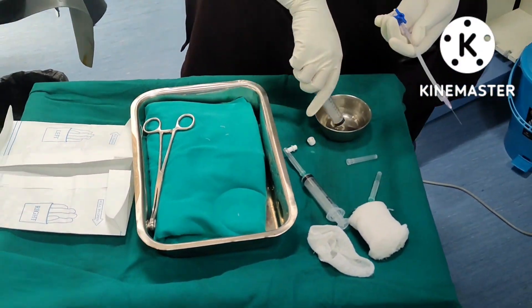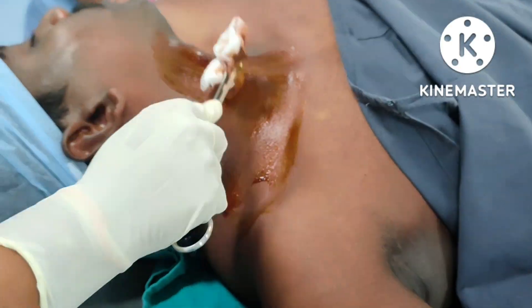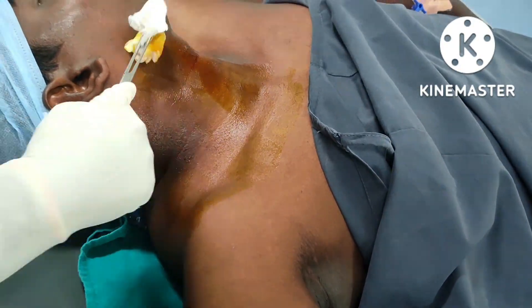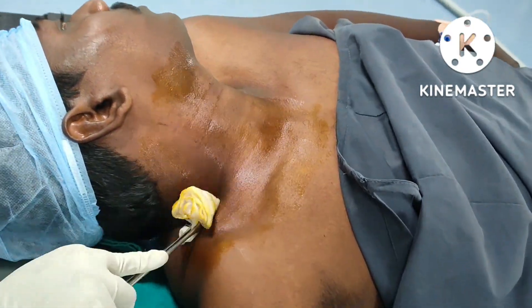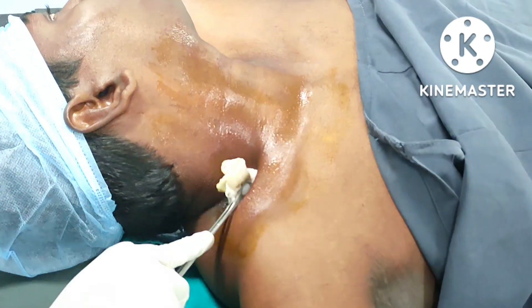Today I am performing a supraclavicular block for a patient with a distal radius fracture. The procedure is k-wire fixation. After cleaning with betadine and sterilizing, I have placed the whole towel. I am taking a 22-gauge needle with a three-way cannula.